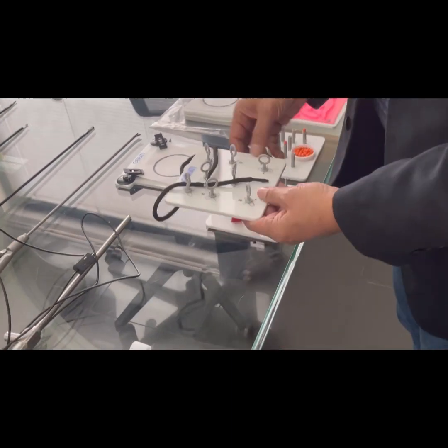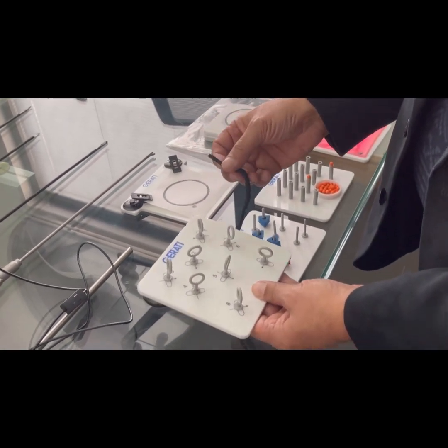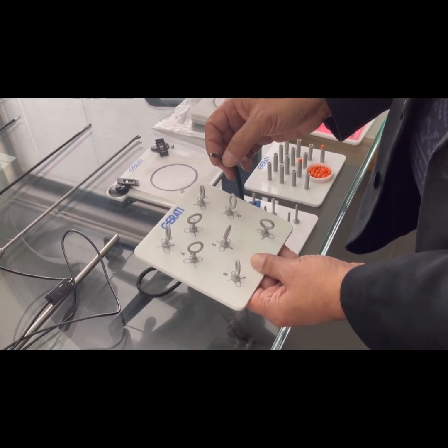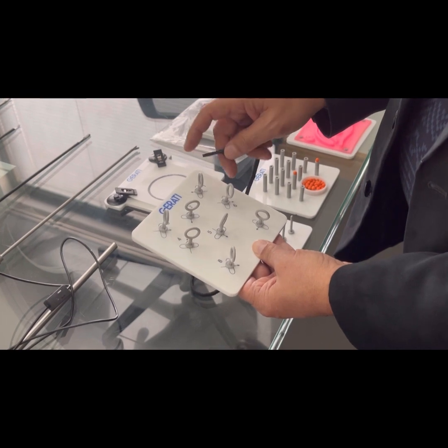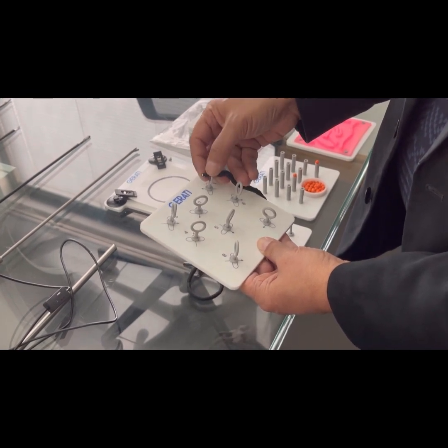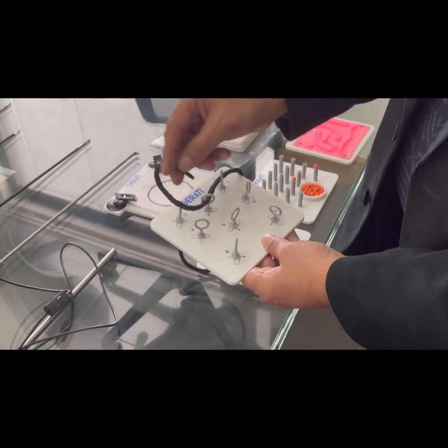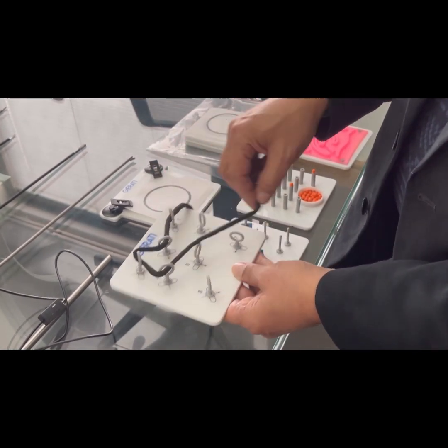The thread hook placement exercise represents a kind of suturing simulator. The exercise pad indicates the direction in which the thread has to be passed through the circular hooks, and all the arrows point to the particular sequence to follow when placing the threads.